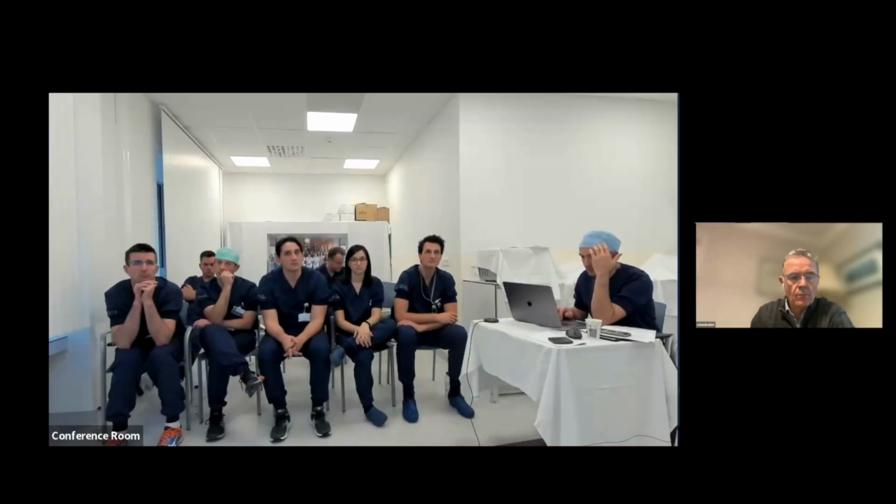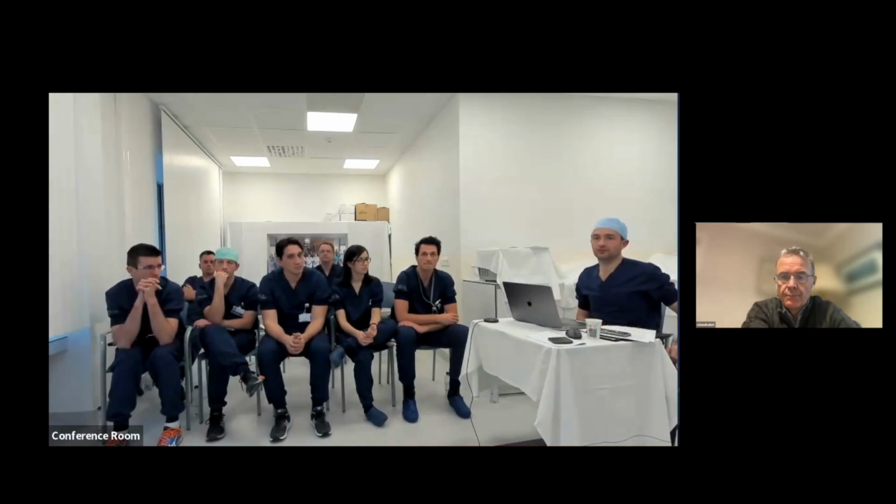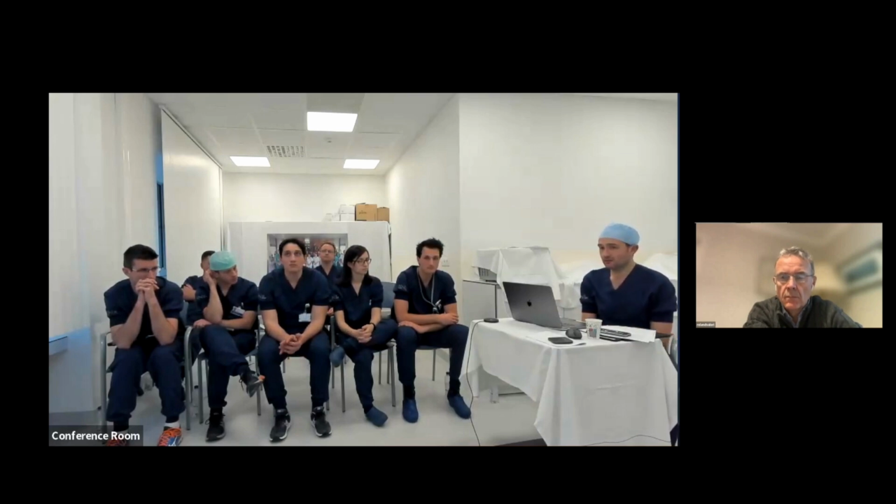So to summarize this part, and the final part before we close, I think you must audit your own practice. These are some of the things you can audit. You maybe should keep a list of the biopsies that you take, associated maybe, if it's possible, with endoscopic images. I think AI will change this space such that you will be able to link text at least to the images, which we still can't do at the moment in our reporting system. And then you will be able to link histopathology to that.